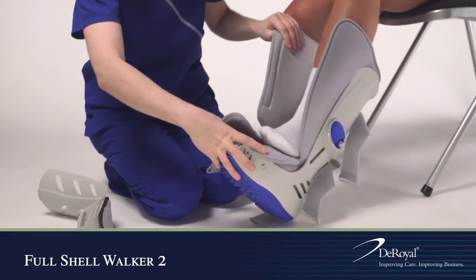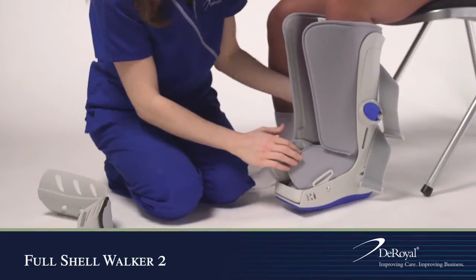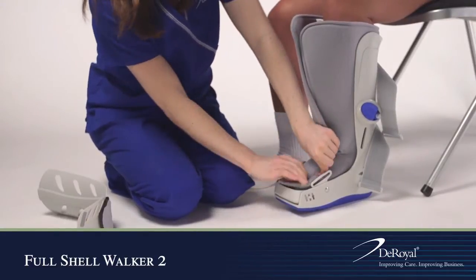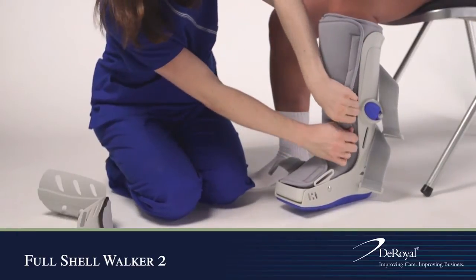With the patient seated, place the patient's leg in the brace and position the heel at the back of the brace. Wrap the liner around the calf and foot, and secure with hook and loop closure.